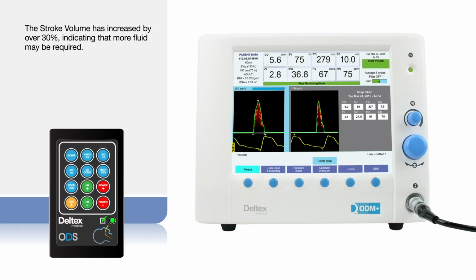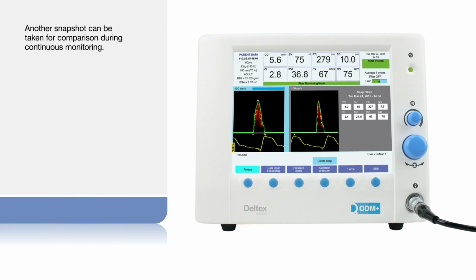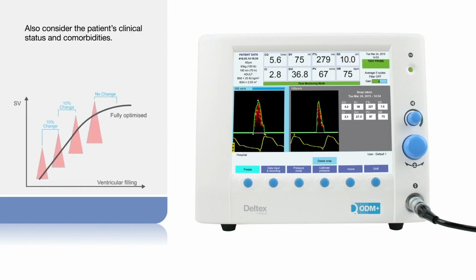You can take another snapshot at this point to record the change in parameters and retain the information for comparison during continued monitoring. The fluid challenge can be repeated until the stroke volume increase is less than 10%, indicating that the patient does not need additional fluid. However, your patient's clinical status and underlying comorbidities should also be taken into consideration.